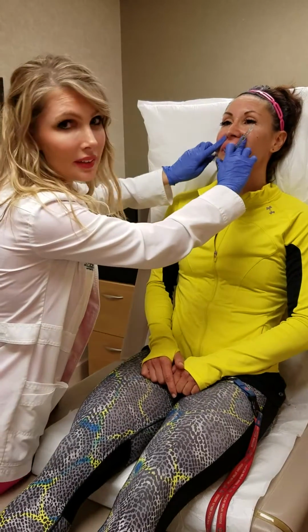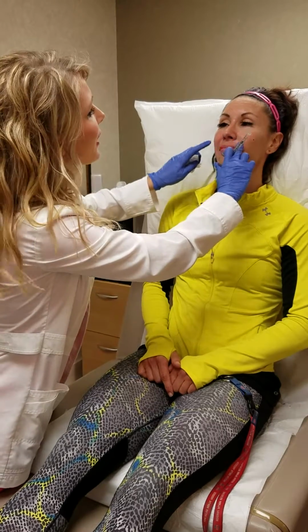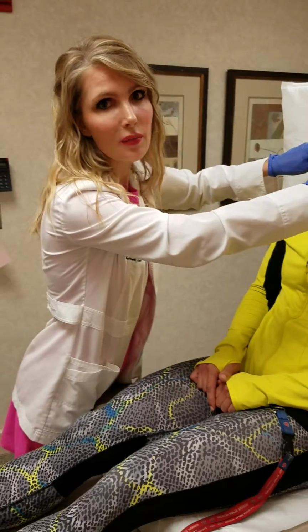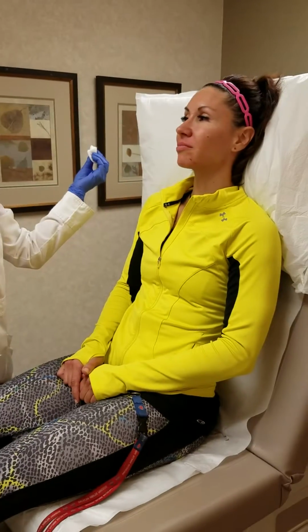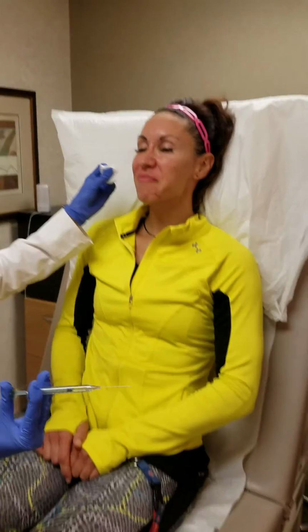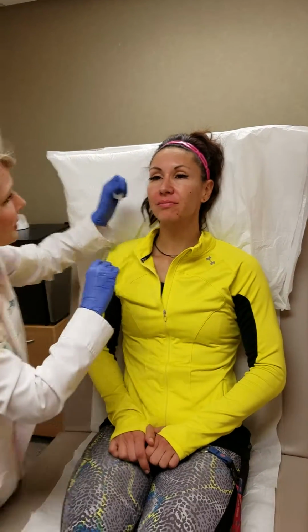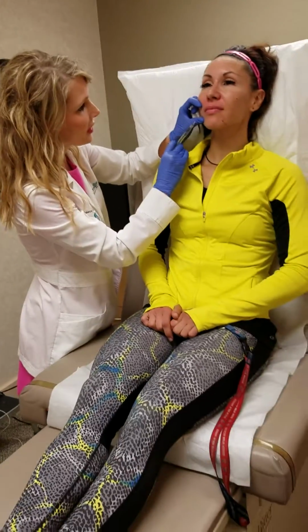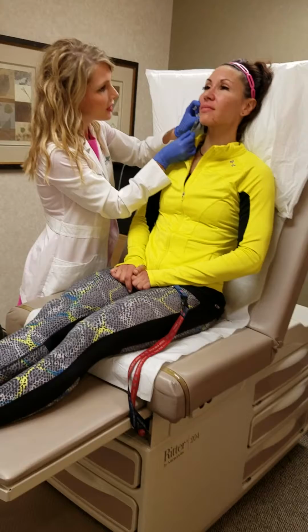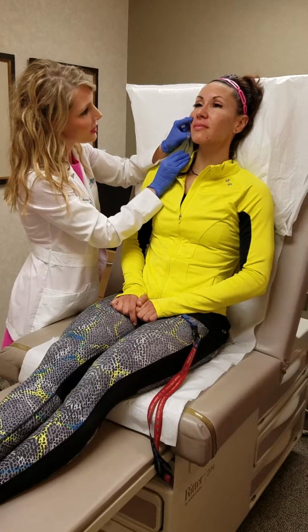We don't want to eliminate the nasolabial folds. And I've had a lot of patients ask me about that. The reason is because it doesn't look natural. We want to soften them, but babies have nasolabial folds. So, you know, adults should probably have nasolabial folds. Yeah, exactly. So this looks great. Let me do just a little bit more right here. And I think we could probably tweak those anterior cheeks just a little bit.